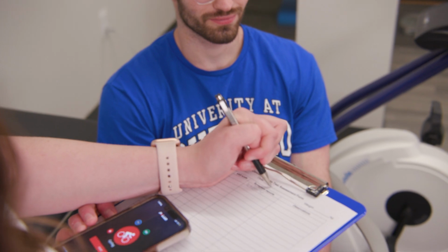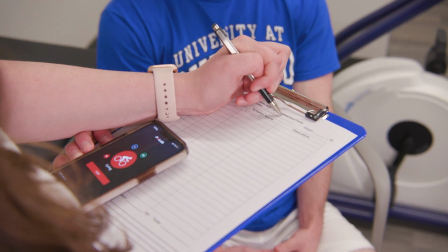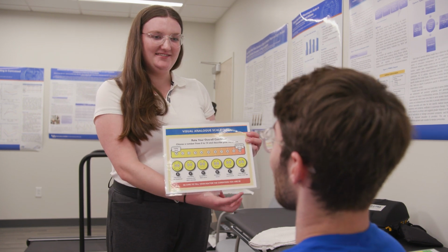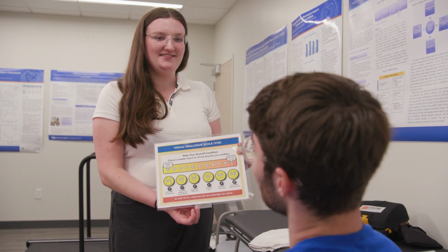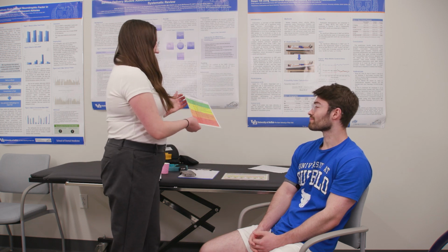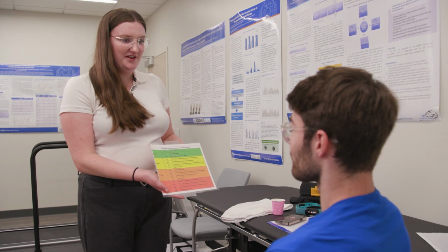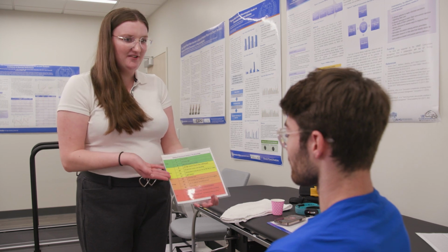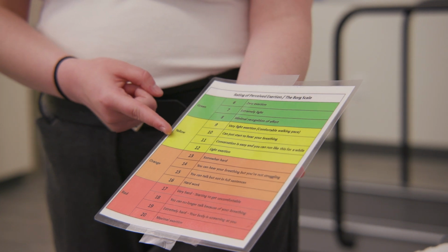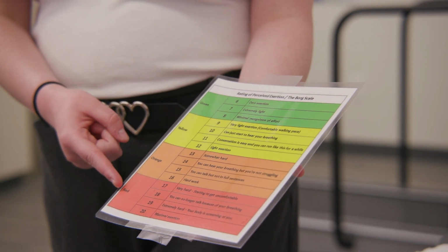Record the patient's heart rate and baseline symptoms after 2 minutes of seated rest. Concussion symptoms should be recorded on the 0 to 10 VAS scale. It is important to explain and demonstrate the VAS and RPE scales before the test begins. You should remind the patient that they will be asked to rate RPE and symptom severity every minute during exercise.